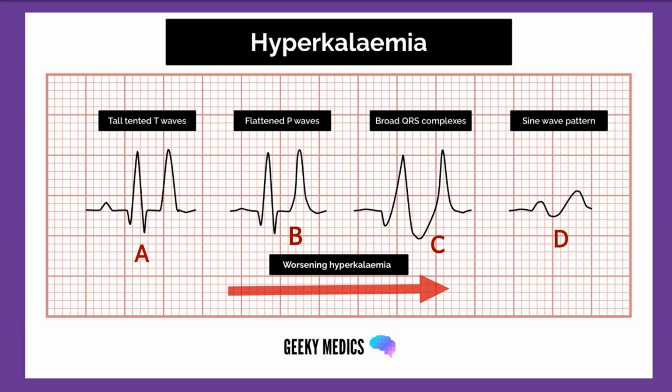Just like I said, the sine wave pattern is also an ECG manifestation, and that signifies a relatively worse hyperkalemia. And of course, you have other arrhythmias that can be shown on the ECG, asystole and the like. And asystole means that the patient is clinically dead, because hyperkalemia can actually cause cardiac arrest.